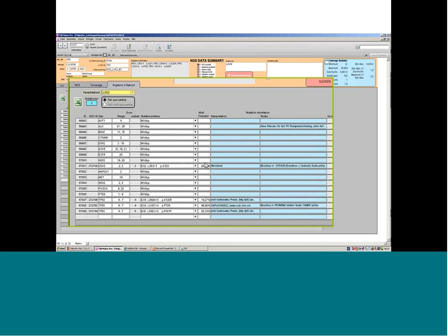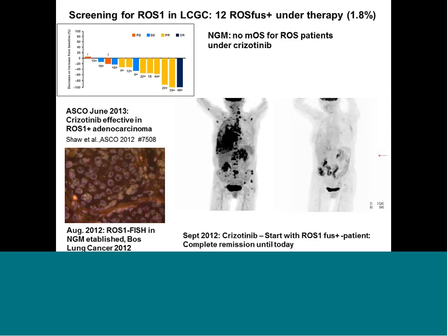modality of the gene? Is it activating the kinase? Is it inactivating? What's the allele frequency? And is there a study available that would be a perfect study for this specific genotype and disease? So the bioinformatic pipeline is actually very important to handle this massive number of sequences from large number of patients.